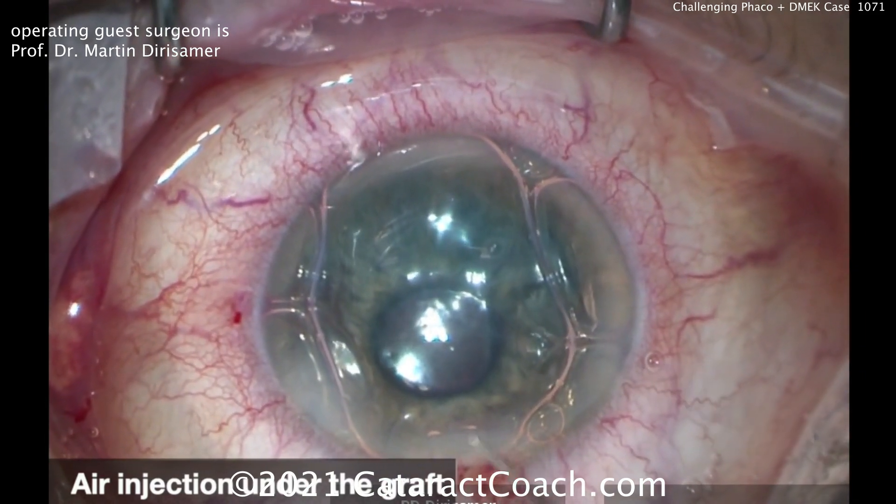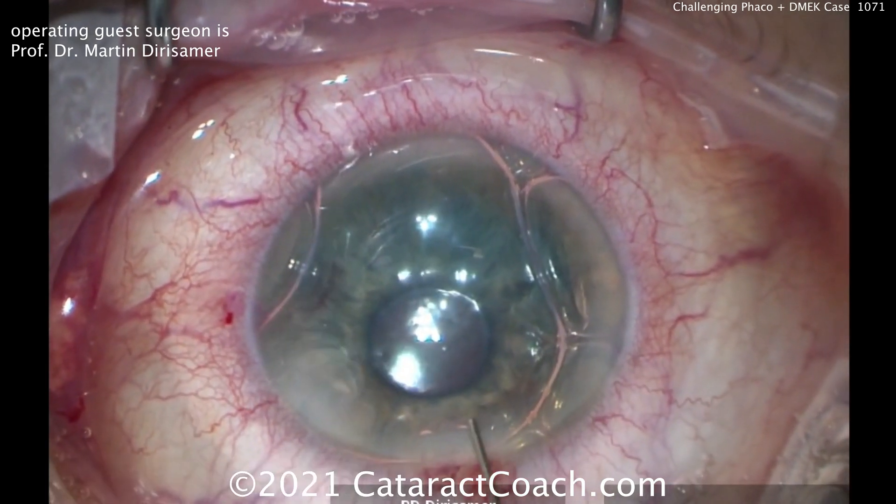16% SF6 is used, which gives you a little bit more time to hold the graft in place.